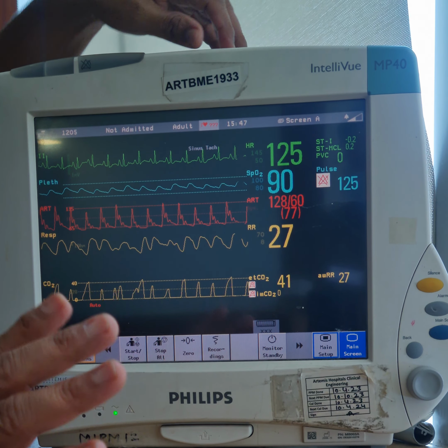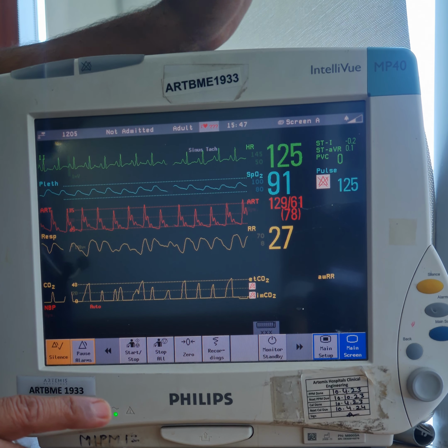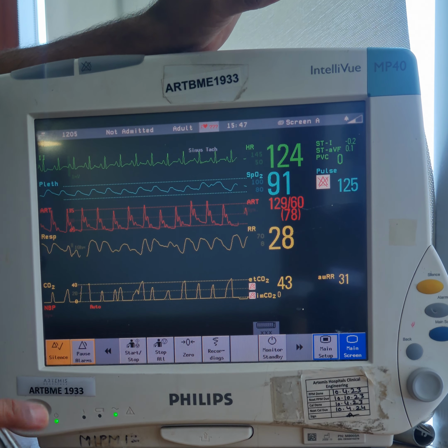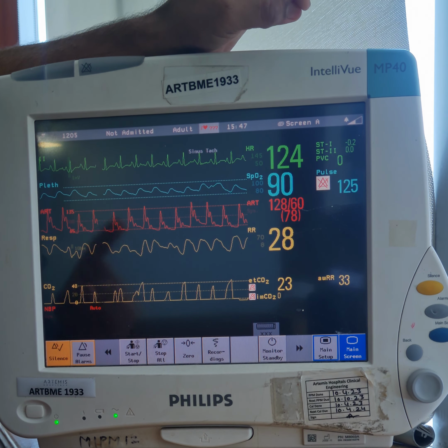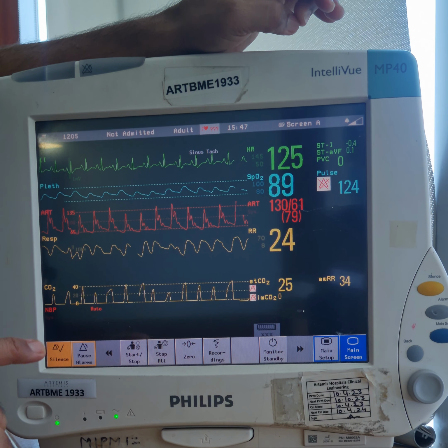I think this is all I wanted to tell you. But make sure that your alarm is addressed and taken care of. Alarms should not be neglected in any case.